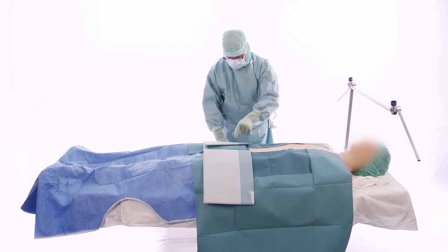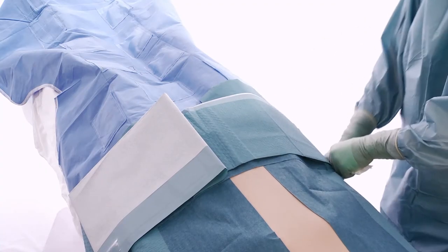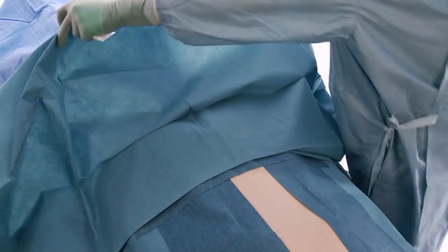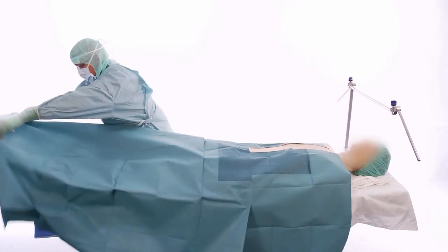Continue unfolding first towards you and then away from you. Press firmly to attach the OP sheet onto the patient. Unfold fully towards the patient's feet.